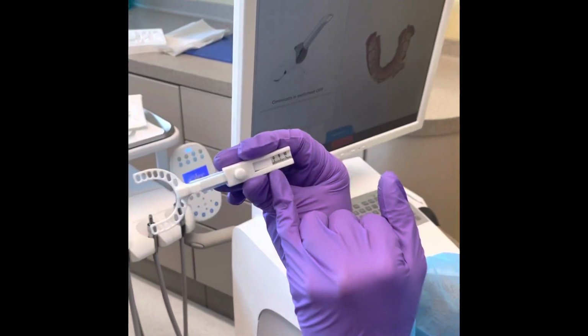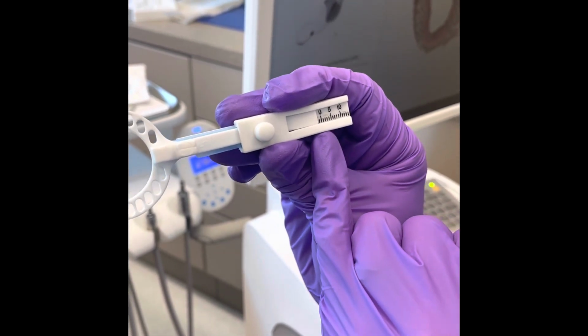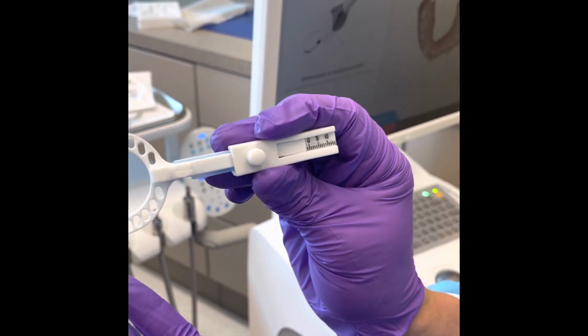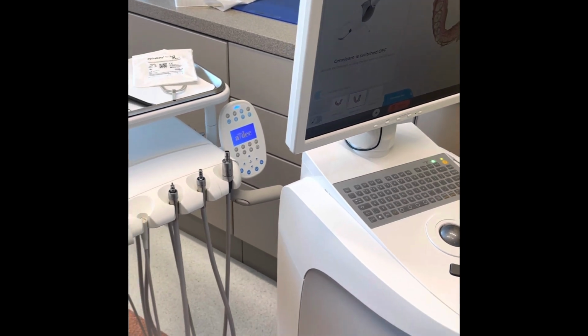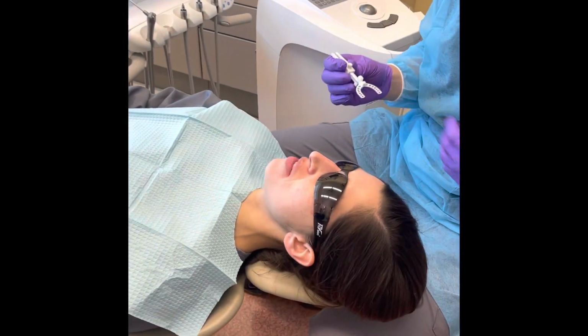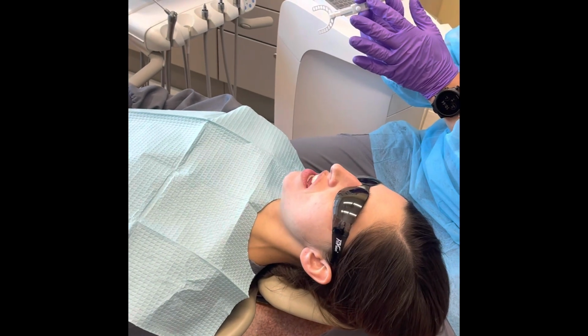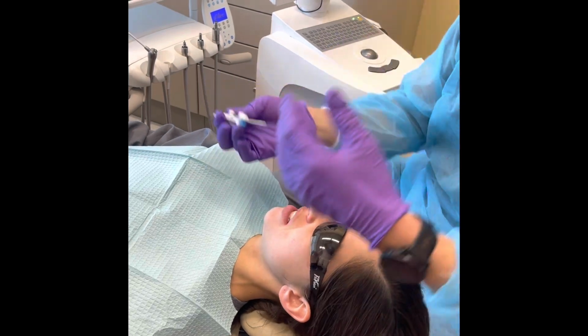So we could go all the way to +7. So right now, if you look at it, we're about 8 millimeters of movement. We have overall 12 millimeters of maximum mandibular movement. So did that feel like it was stretching your jaw at all, or not necessarily? The 7, all the way forward, yes. Okay. What about this one I just had it at, where you were trying to snore? I mean, it's not like super comfortable, but it's... Well, let's do this.